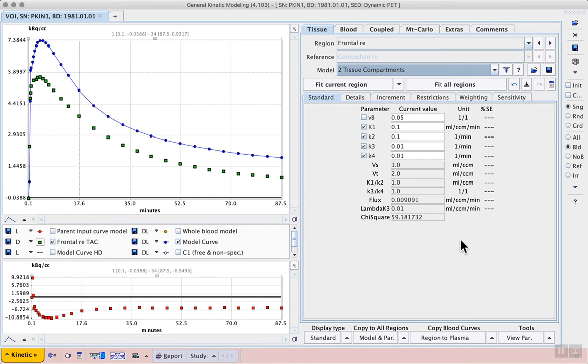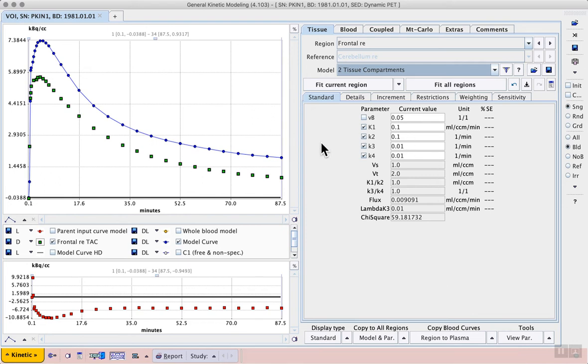On the right hand side we see the default starting parameters for the two tissue compartment model, and these will be adjusted when we fit the model.